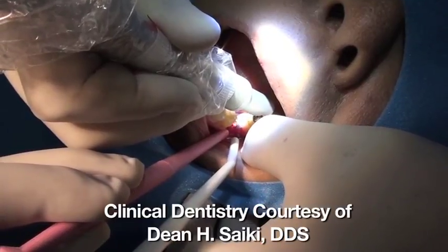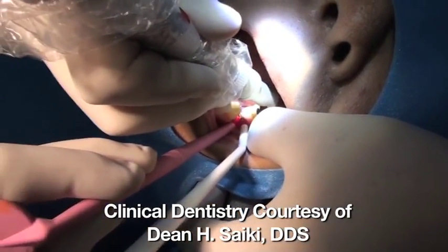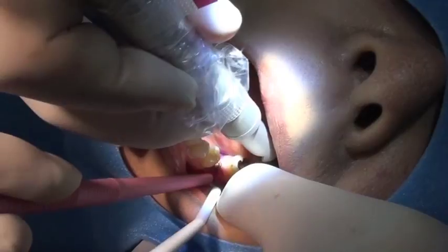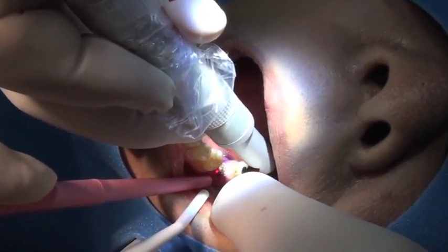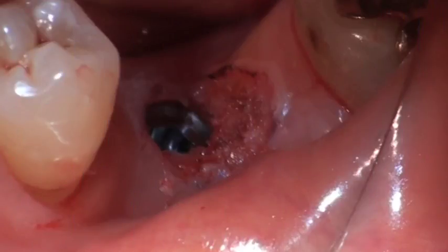One of the options you have with an inclusive tooth replacement solution is, at the time of surgery, you can make a decision whether it's appropriate to immediately provisionalize the case or to place a custom healing abutment. Either way, you're starting to set up and sculpt the soft tissue in appropriate contours for superior restoration down the road. This case is courtesy of Dr. Dean Saiki, who has just placed the implant and is using a CO2 laser to create that ovate pontic space, which you see here.